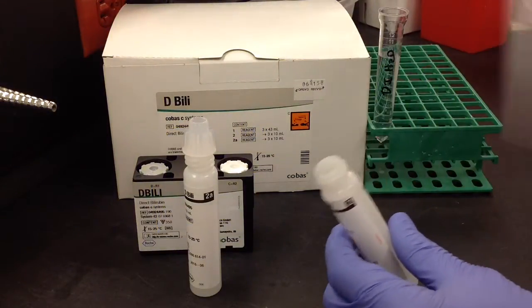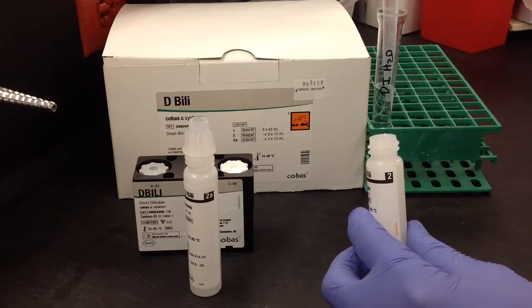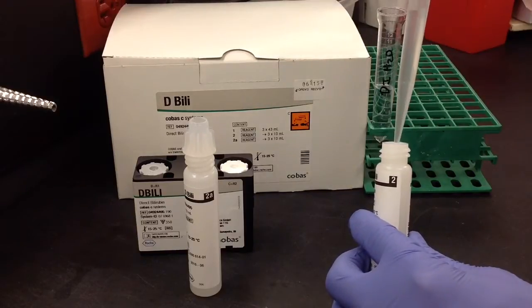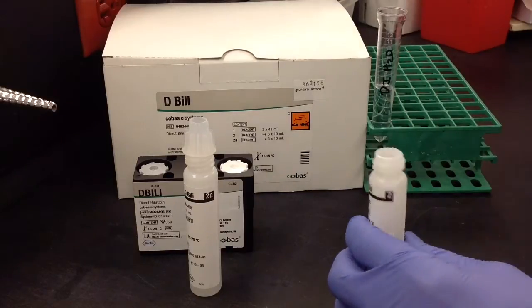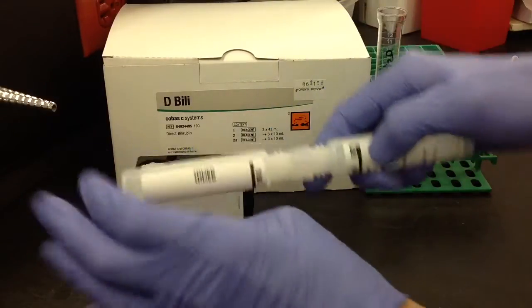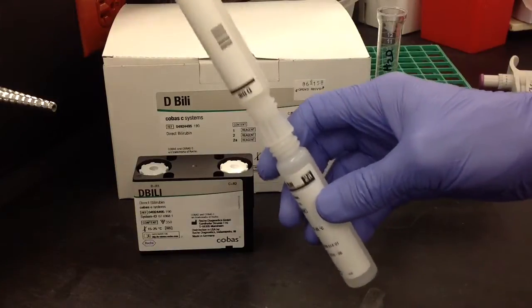Go ahead and take your pipette and add 4 ml of DI water into the now empty reagent container, and then just go ahead and reconnect that to 2A or 2, whichever one, and then go ahead and mix that 10 times.